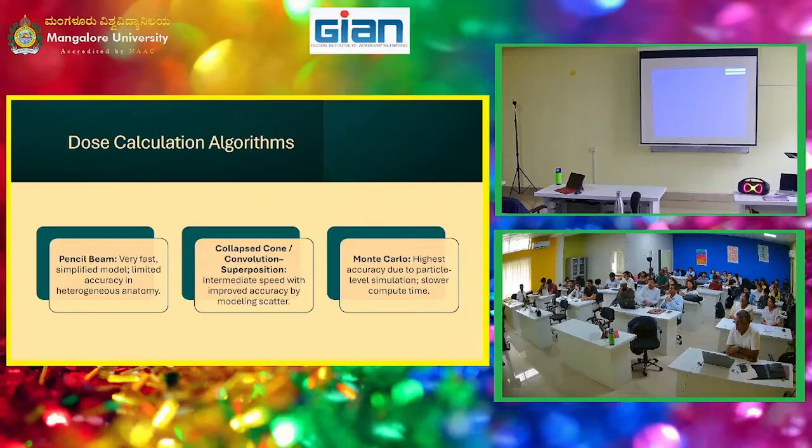This one is more computationally complex, and therefore the solution takes longer to come out. And then the last is Monte Carlo. If you're in the world of statistics, Monte Carlo is iterations and complexity, very complex, and that takes the longest to simulate the answer.